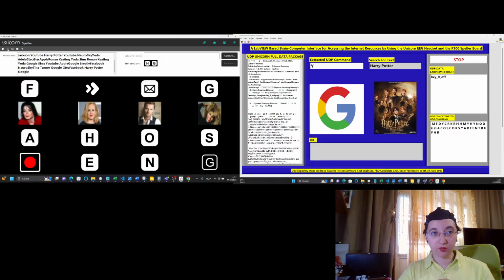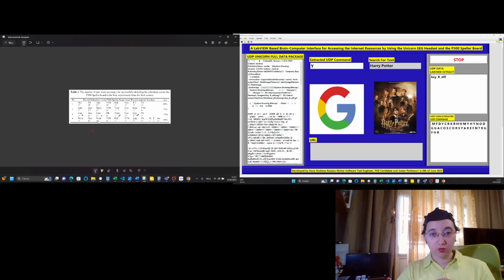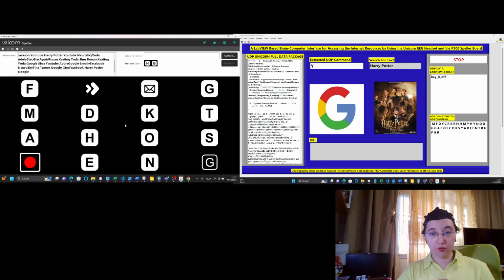The next task is requiring to search for Yoda in YouTube. So firstly, I'll focus my attention on this symbol O from Yoda, and then I'll focus my attention on this symbol from YouTube.